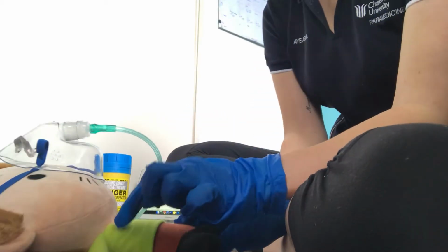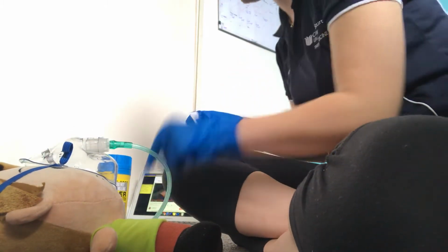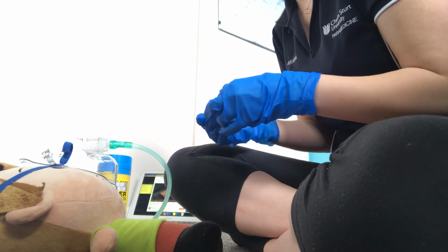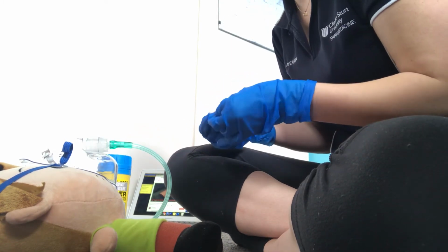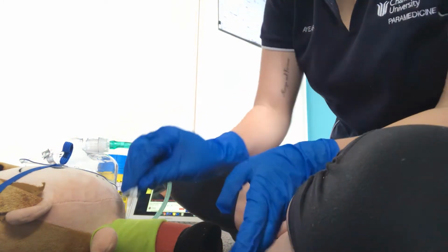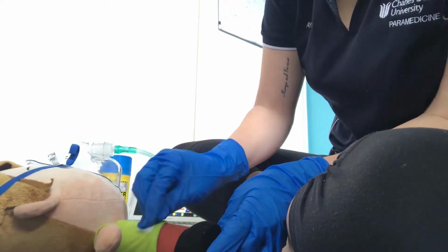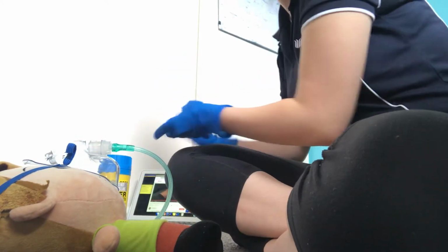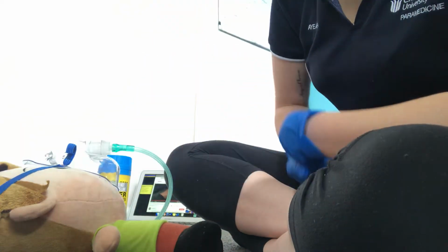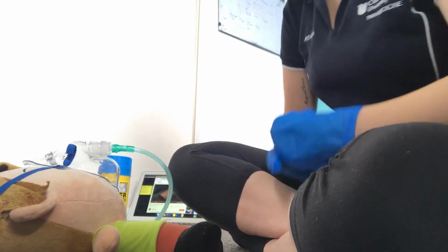So now that we've got our site, which is just there, we're going to swab the area. We're going to do this using an aseptic technique, and we're not going to touch the site once it's been swabbed. So just going to pop that in the bin, and we're going to allow that to dry. Okay, so now we're going to move on to the procedure.